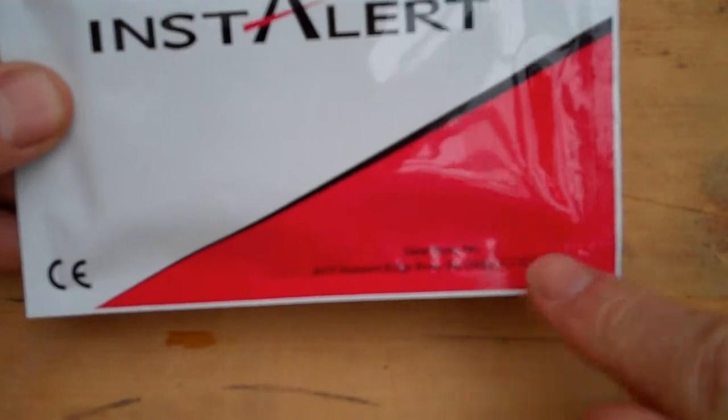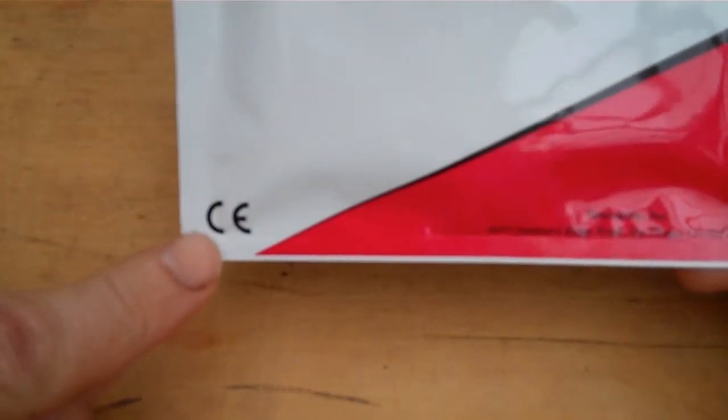Innovacon is the manufacturer based in North America. CE marked, and on the reverse of the foil you'll see the basic coding information, which is the multi-drug one-step test panel screen DOA 1104. Standard coding for a 10 panel is 1104 with the InstAlert product, and you'll also see the drug abbreviation codes, which is the standard format that's chosen on that 1104 panel.